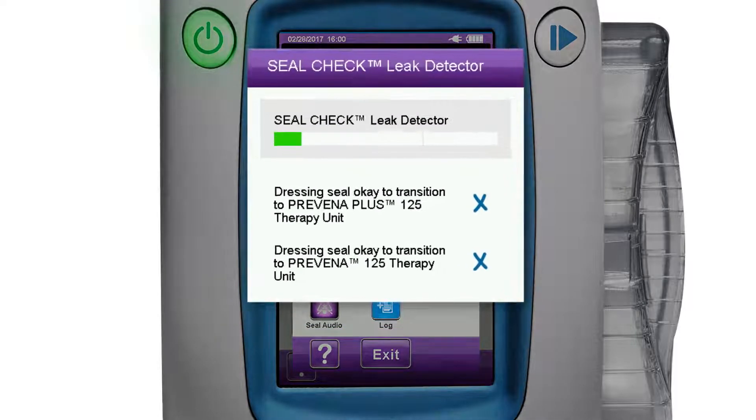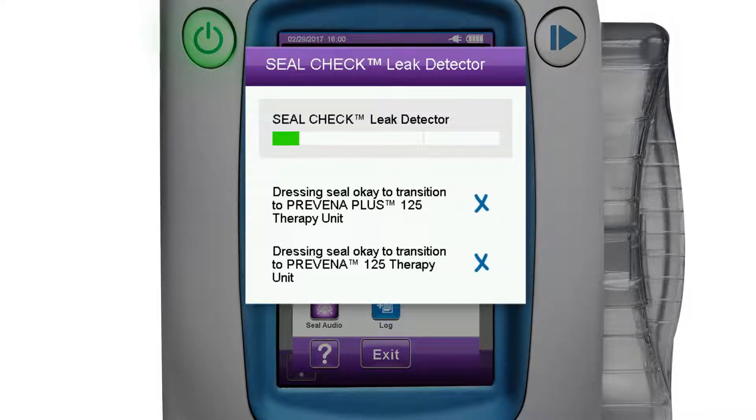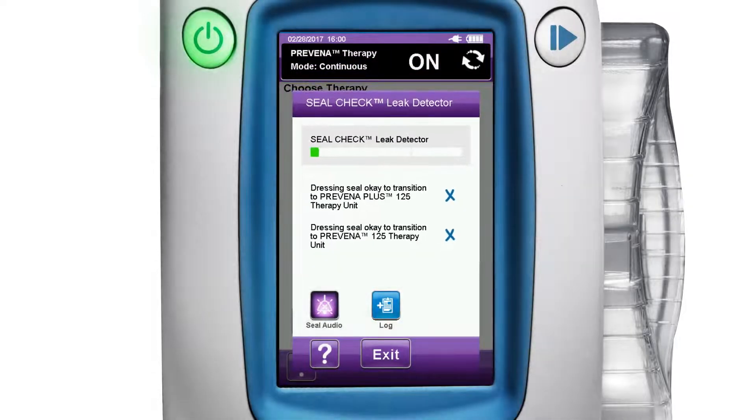The seal check screen assesses leak rates for subsequent transition to a portable disposable therapy unit, such as the 3M Prevena Plus 125 therapy unit or 3M Prevena 125 therapy unit. The seal check leak detector screen will display an X if the dressing seal is not adequate, which would trigger an alarm on the Prevena therapy unit. It will display a check mark if the dressing seal is adequate for use with the associated Prevena therapy unit.